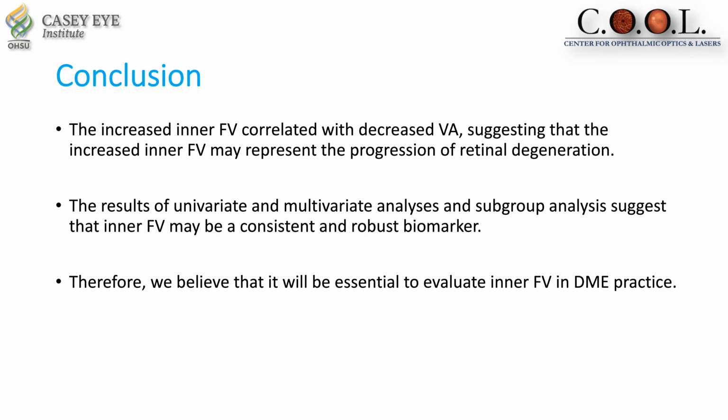In conclusion, the increased inner fluid volume correlated with decreased visual acuity, suggesting that the increased inner fluid volume may represent the progression of retinal degeneration. The results of univariate and multivariate analysis and subgroup analysis suggest inner fluid volume may be a consistent and robust biomarker. Therefore, we believe that it will be an essential biomarker to evaluate inner fluid volume in DME practice.